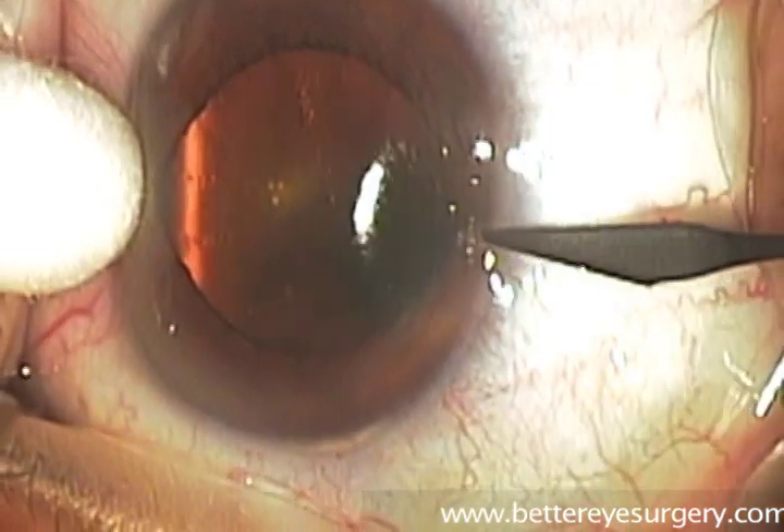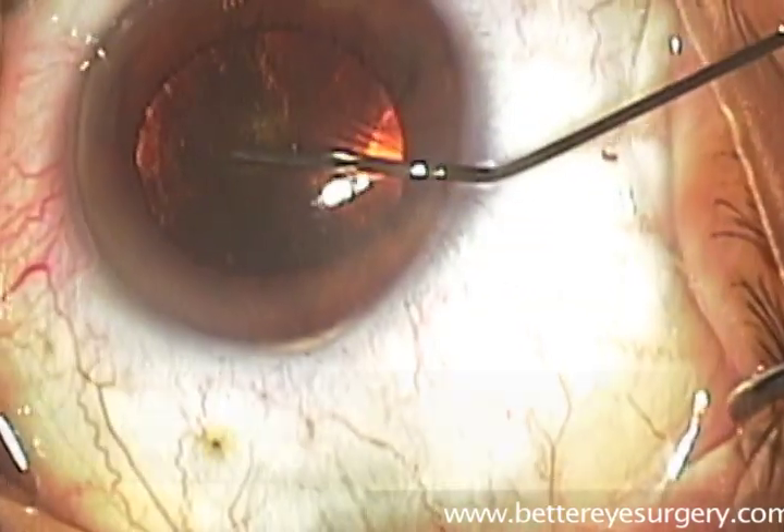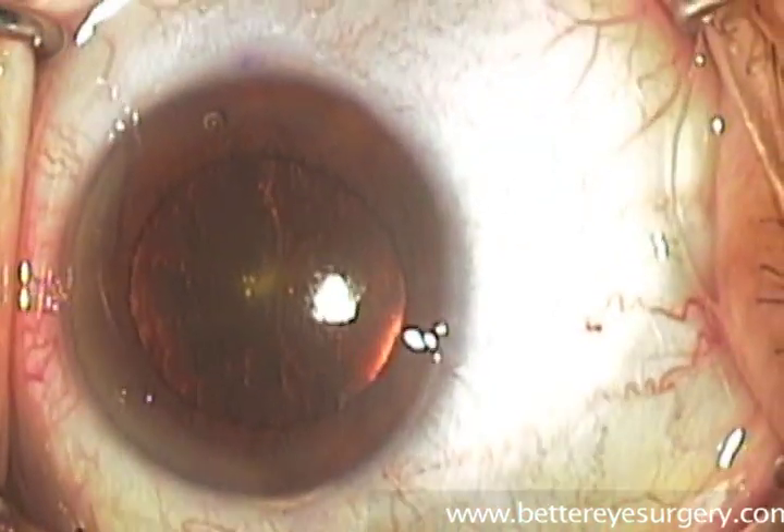Cataract surgery begins with a small incision, usually to the surgeon's left, through which a gel-like material called viscoelastic is placed inside the eye.